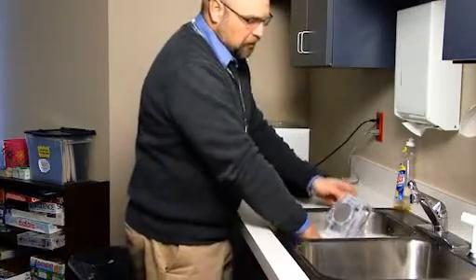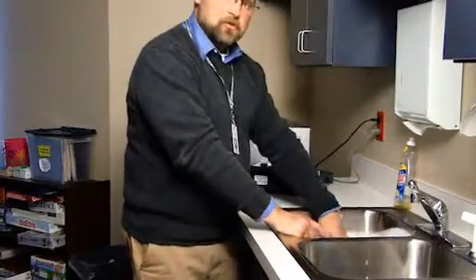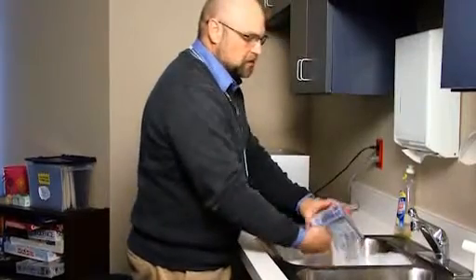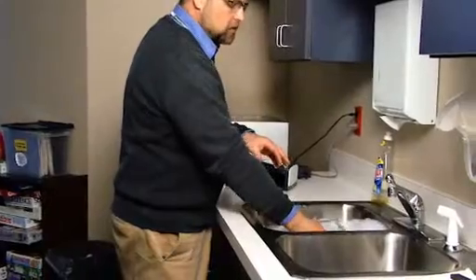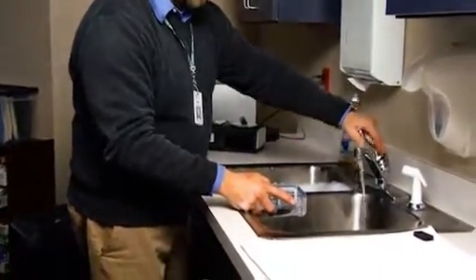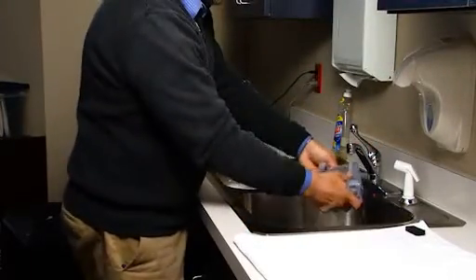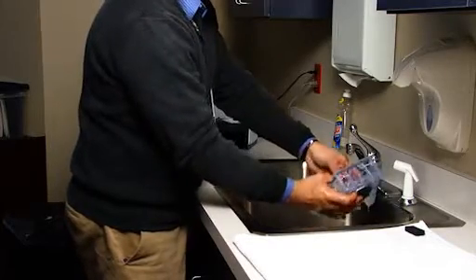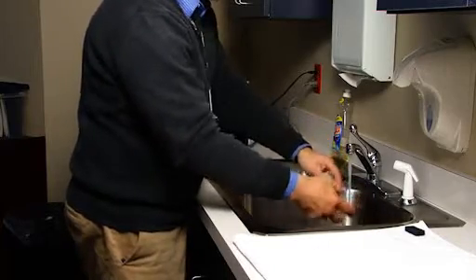The other thing with the water chamber itself, it is dishwasher safe. So if you want, you can put it in the top rack of the dishwasher, run it through a cycle and just let it air dry. This way I'm doing it without the dishwasher, and I just put it in the sink and then turn on some rinse water, and make sure that you get all the soap off of it and rinse it out good. The reason you want to rinse it out good is you truly will be laying there at night and you're going to start smelling that soap.